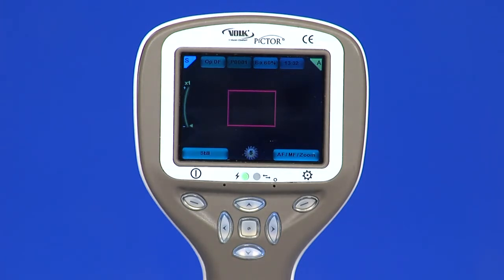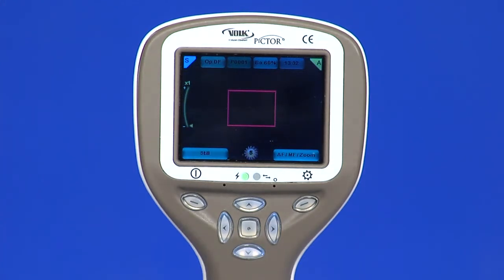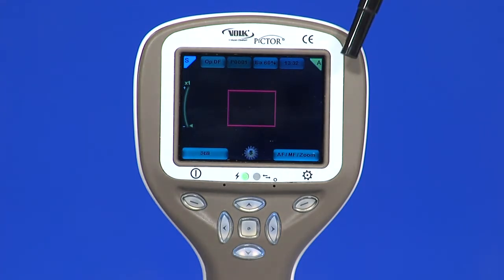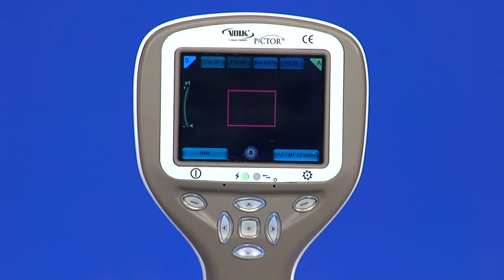P0001 indicates this is patient 1 folder. BA indicates battery level as a percentage. The next icon is the time. At the top right is the focus indicator. M is manual, A is auto, Z is zoom.